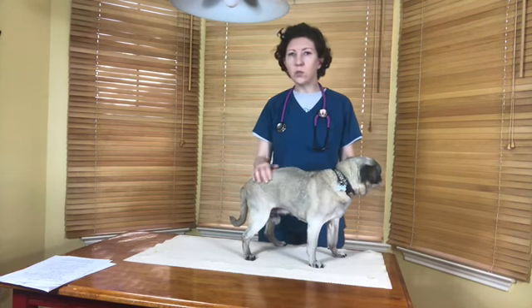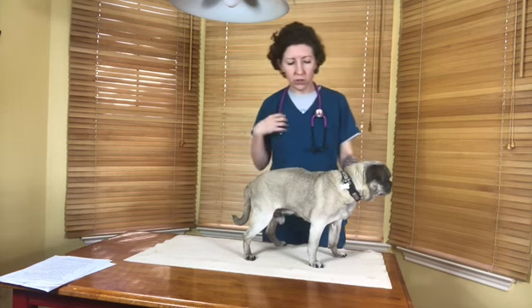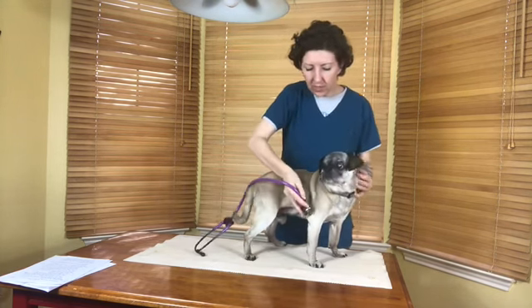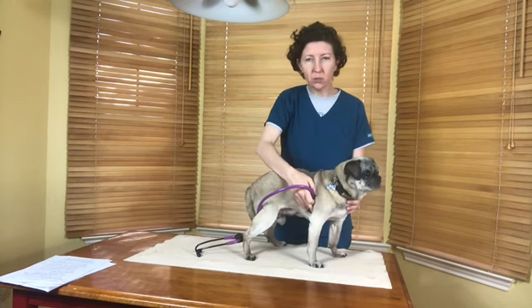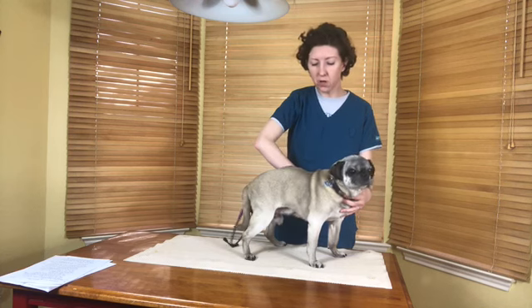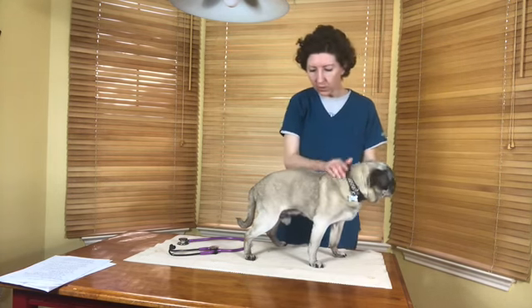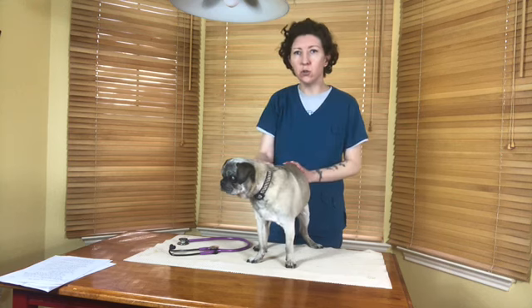So today we're going to auscultate heart and lungs. To do this on a dog, you would use your stethoscope and place the diaphragm right behind the elbow on the chest while the dog is standing. You would do this on both sides of the chest. For cats, you would start in the center of the sternum and then move outwards to the left and right. Normal heart rate for dogs is between 60 and 160, and for cats 140 to 220.